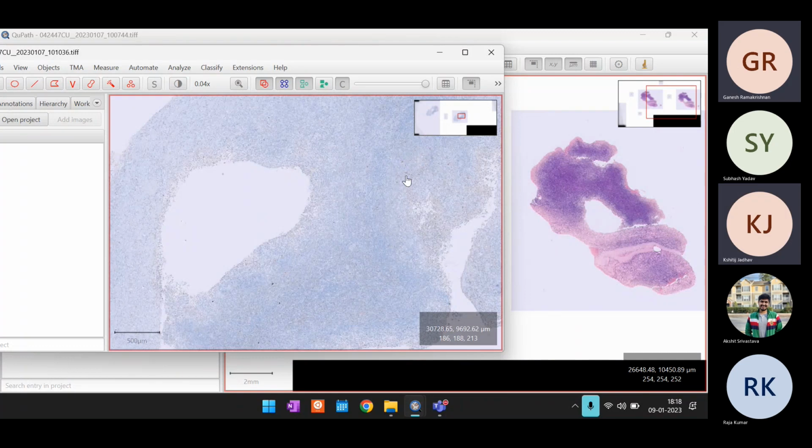But instead of doing it in a very ad hoc manner, if you could do targeted selection, then we maintain alignment with the Reed-Sternberg cells, the targeted set that we have, and also help create targeted clustering. But the targeted clustering will be for only these Reed-Sternberg cells, right, Professor Ganesh? That is not what we want; we want to do it for the microenvironment.